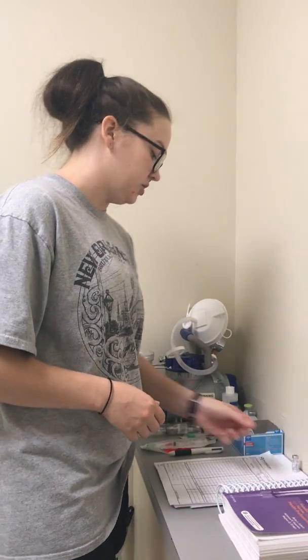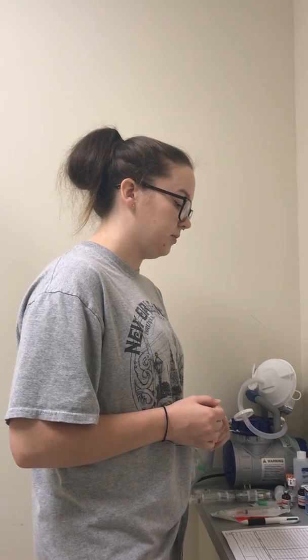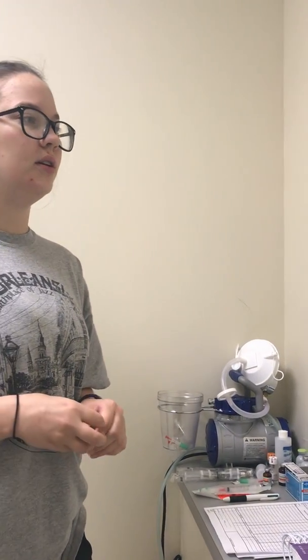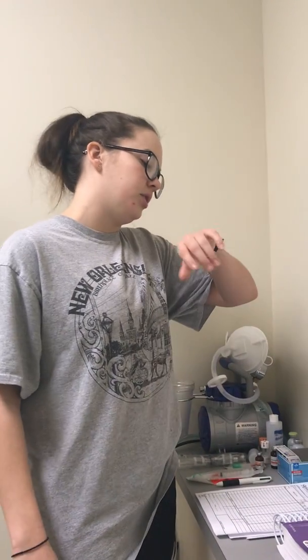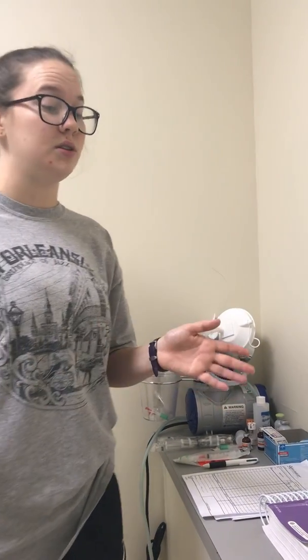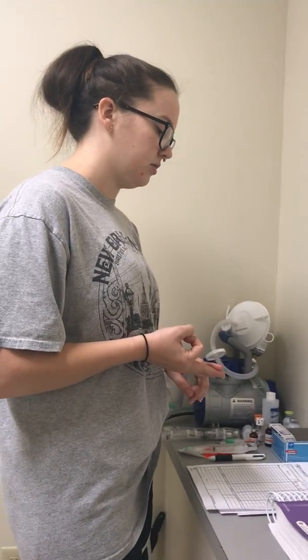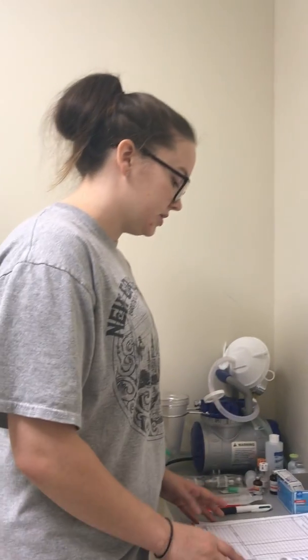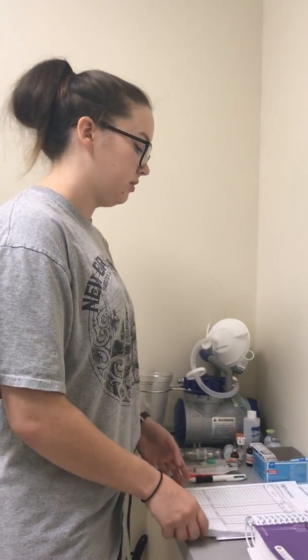It's a 4 milligram per milliliter bottle. So the right medication, the right dose, which is 2.5 milligrams. Got the right route, which is IV push, and then the right patient, which I would read the name on my MAR. And looking at my time, it's almost 10 o'clock, and the medicine is due at 10, so that's the right time. So we got right patient, meds, dose, route, and time. So I check to see on my MAR if I have any allergies, which I do not.